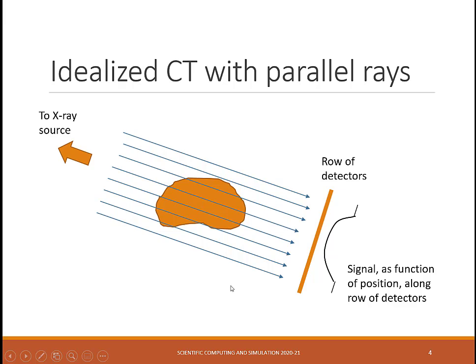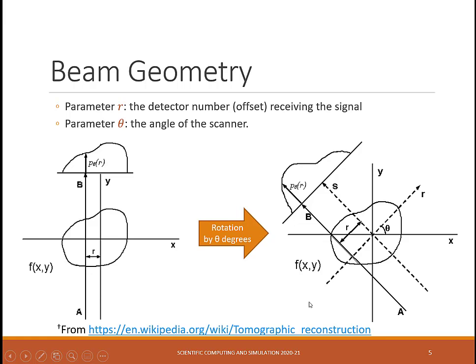As you might know, in computed tomography, the X-ray generator rotates around the body to take X-ray measurements from different angles of the body. All the raw data received by detectors are then processed to produce a cross-sectional image. In this slide, we want to further detail how computed tomography works. Suppose we have a subject like this.